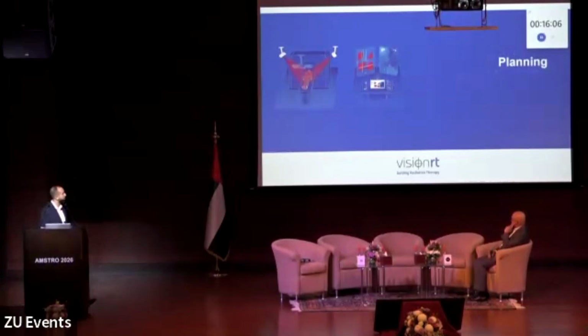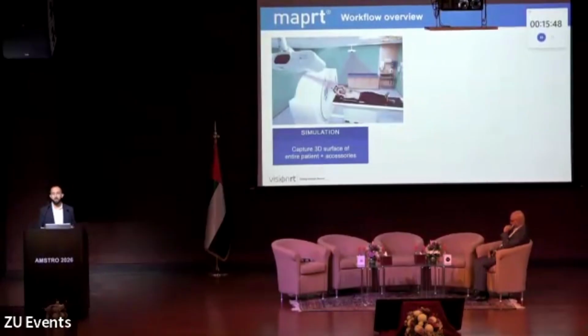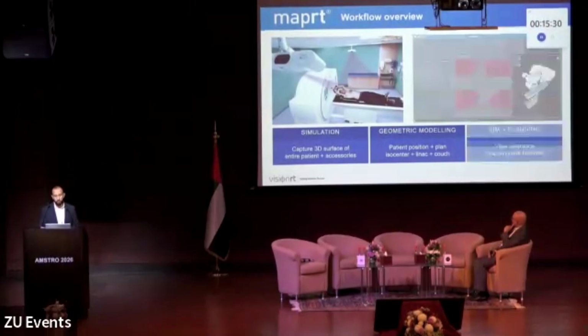Let's go to the next step, which is the planning with MAP-RT. The same camera goes also into the CT room, but in the case of MAP-RT, you will have two cameras on the side of the couch, with a field of view that goes to about 2 meters. You can have the surface of your patient from head to toes, plus the immobilization devices that you are going to use for your patient.